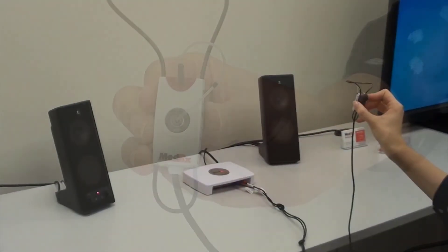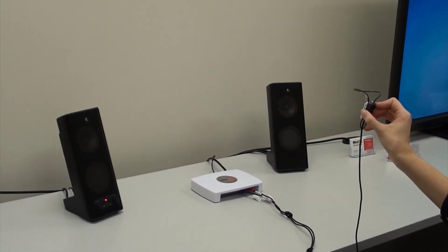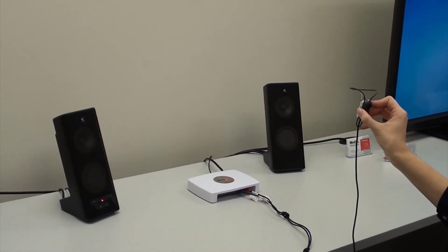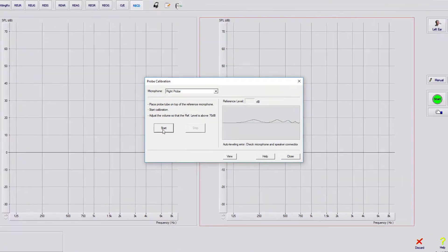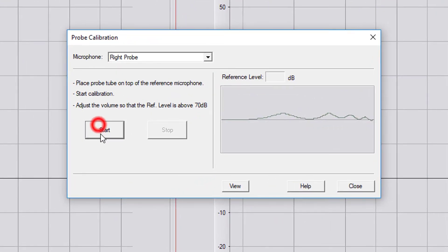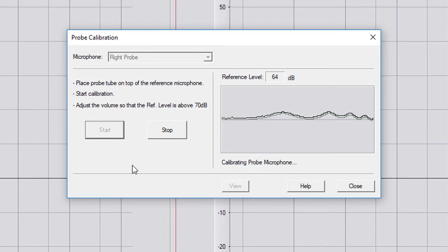Hold the probe microphone roughly one-half to one meter from the speakers. Click Start to run the calibration. If using the REM Plus or ARC system, do this for both the right and left probe.